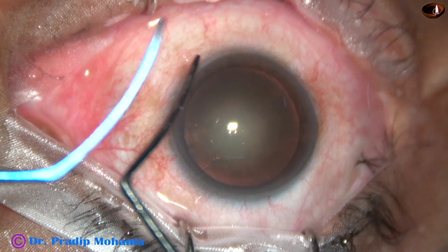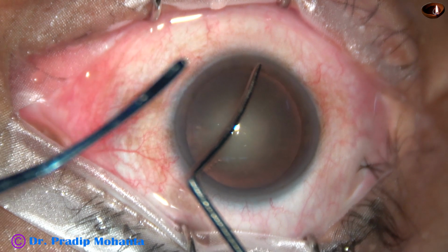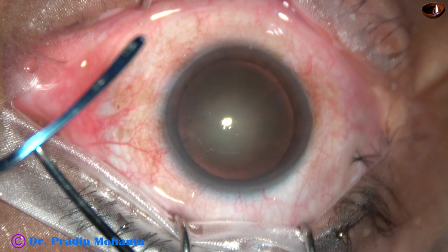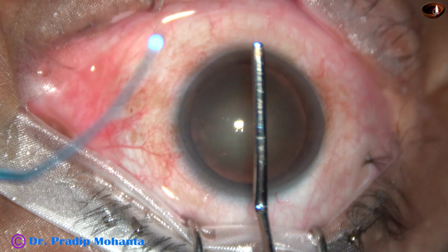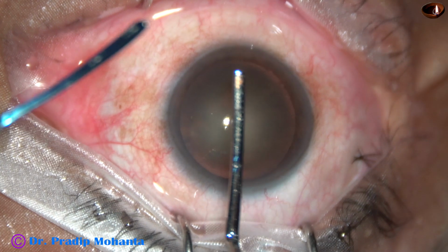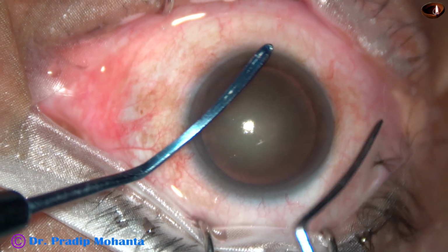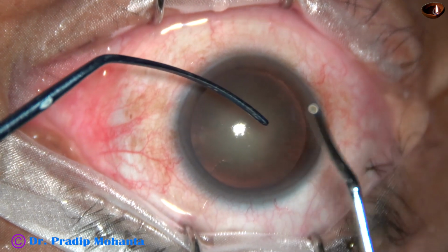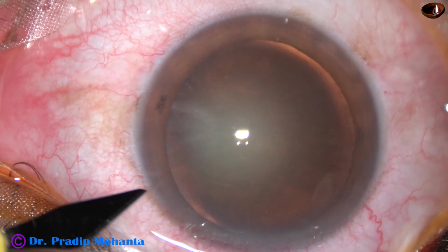The curvature of the iris spatula conforms to the curvature of the anterior surface of the lens, whereas the posterior capsular protector has a curvature that conforms to the curvature of the posterior surface of the cataractous lens. And now this is the iris spatula on the right side and the posterior capsular protector on the left side.